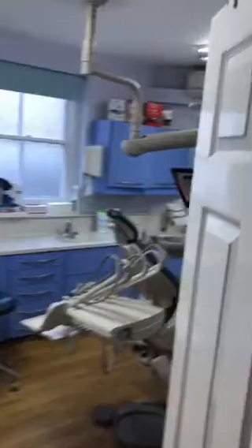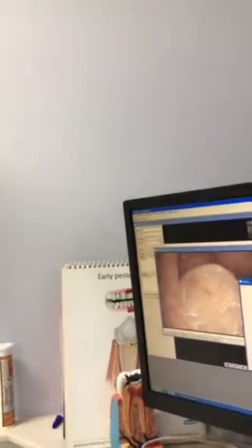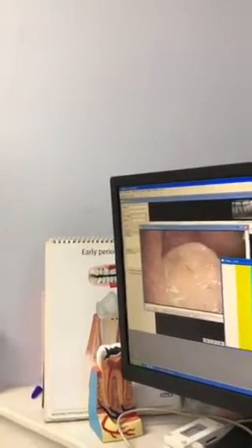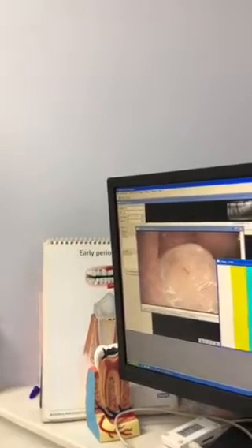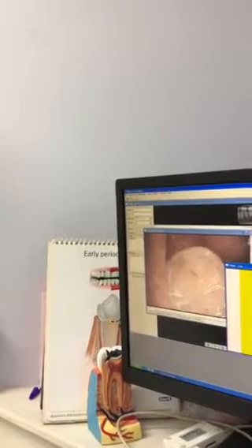There are other imaging techniques that tend to be employed in dentistry, including what are called CT scans, which are becoming far more common, certainly over the last 10-15 years, when planning, especially implant cases. There are relatively few these days, but some practices have CT scanners on site.